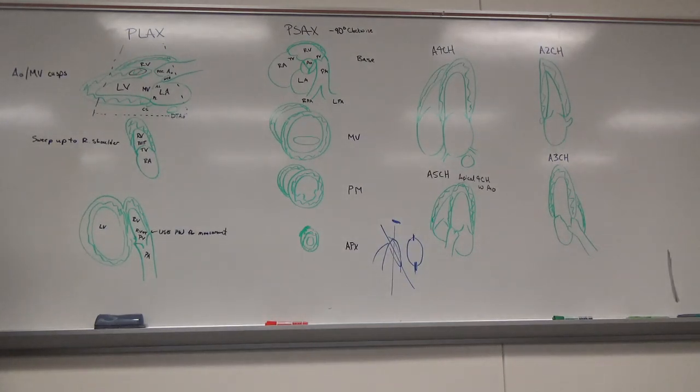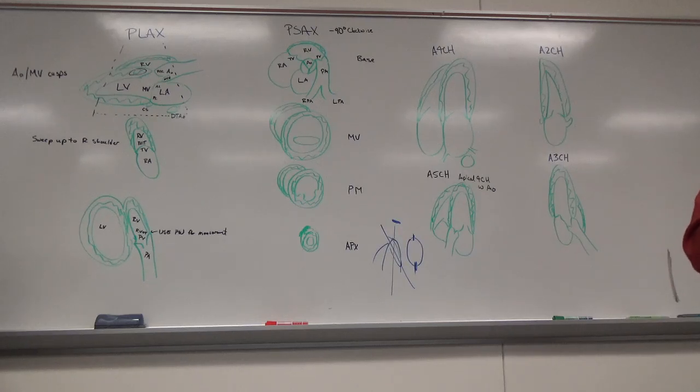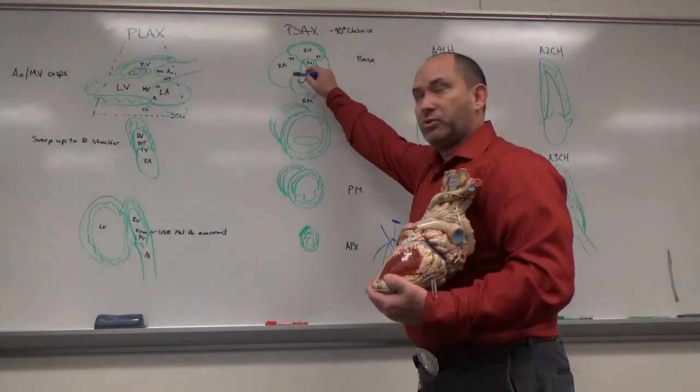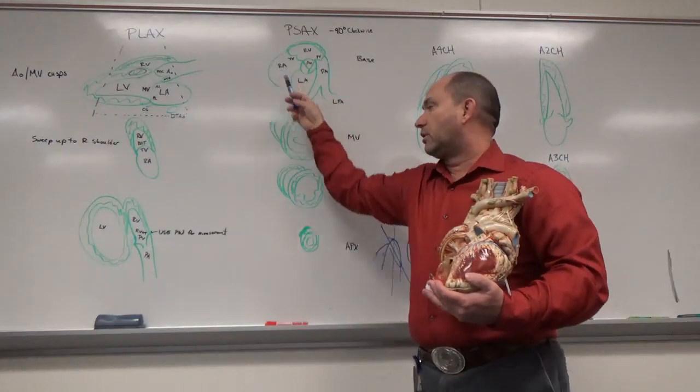What is the foramen ovale? So foramen ovale is the normal. If I'm looking at it, it's going to look like an ovoid shape, and that's made by your septum secundum and septum primum. They come together, they fold a kind of a valve over top of that. In fetal circulation, that's open, allowing blood flow to go across to bypass the right heart because it doesn't need the lungs when it's in the womb because it's oxygenated by the placenta. So if I see problems with that wall, I'm looking for holes going across it. I'm looking for leaks going across it.